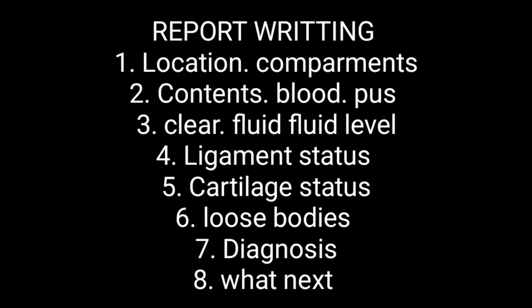And after that you must also advise what next, whether any aspiration is requested or if any MRI scan is required. So whatever you think, your report should have all this information for the ease of the clinicians.